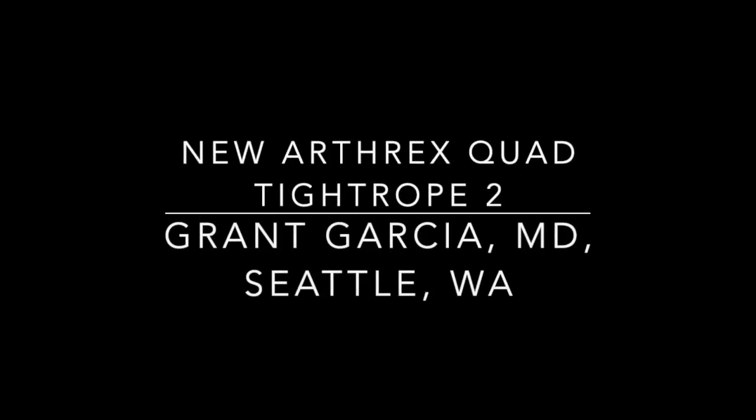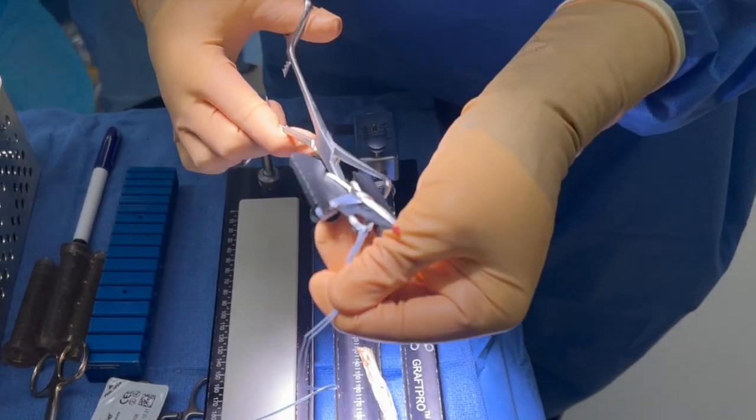Today we're going to demonstrate our technique using the new Arthrex Quad Tightrope 2. This is an updated device using pre-filled internal brace.